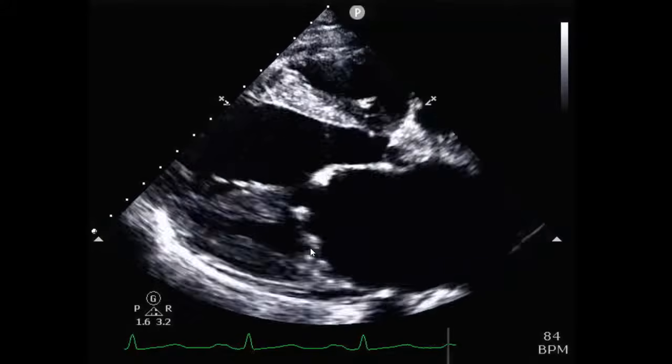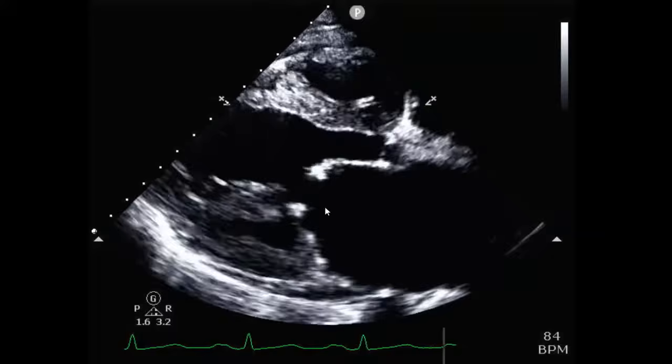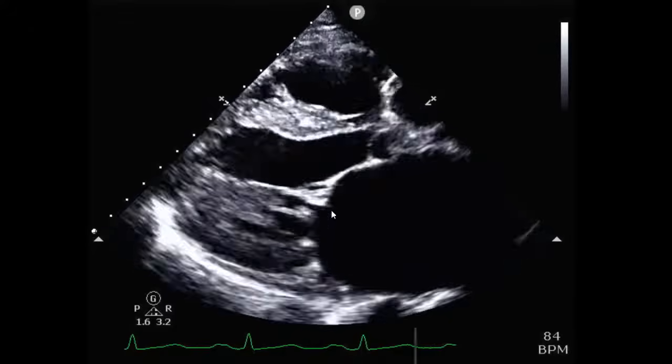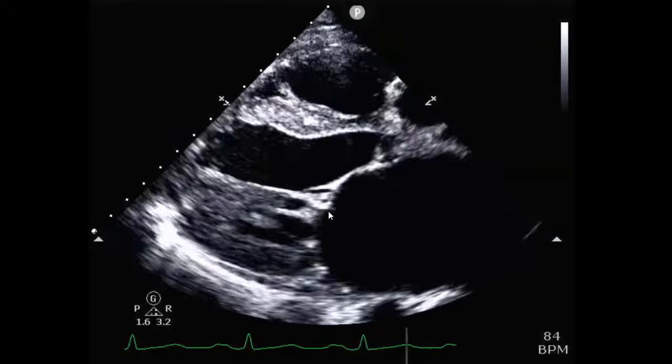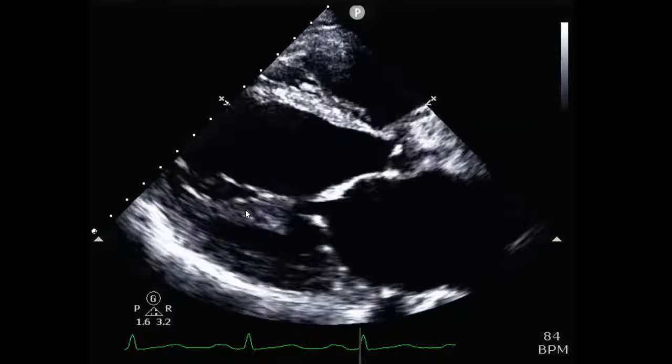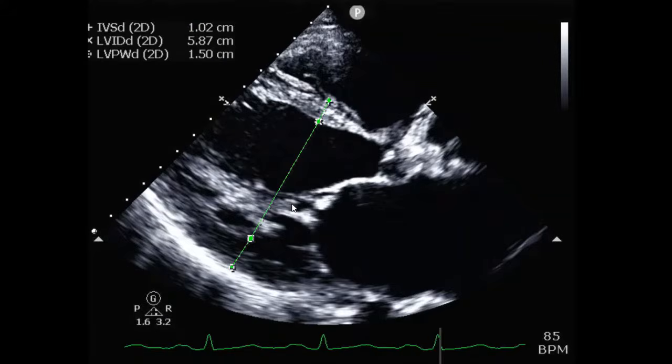While the mitral valve does not open so well, you see at the end during systole, there's a little gap here, which leads me to think that there may be an area of malcoaptation and subsequent mitral regurgitation. Measuring the end diastolic diameter, indeed it is quite large, measuring a distance of 58 millimeters.